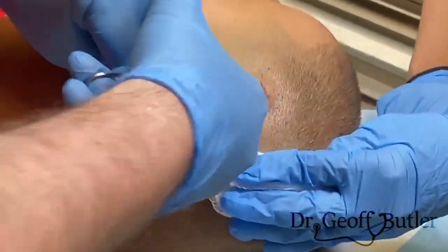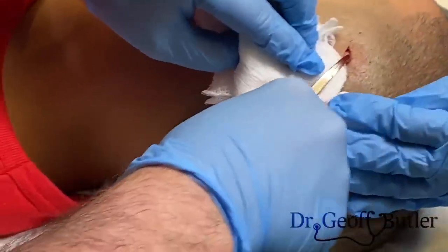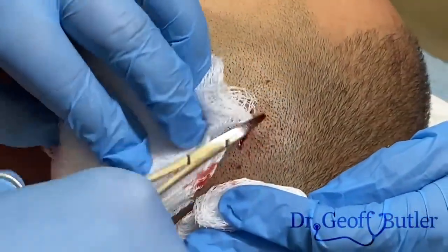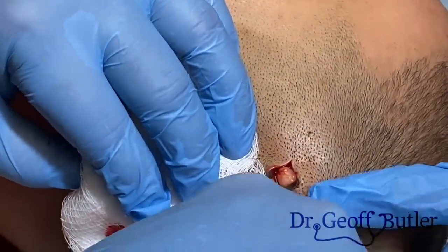Where would the vascularity be? Where would you see it? Like on the actual capsule or around it? Yeah, so see how this is nice and pearlescent? That's nice normal tissue, sort of a yellowish cream color. You'll see that the cysts will look purplish, or they'll look very, very reddish. So this is dissected down. You can see how it's popping out as I'm pushing that there.